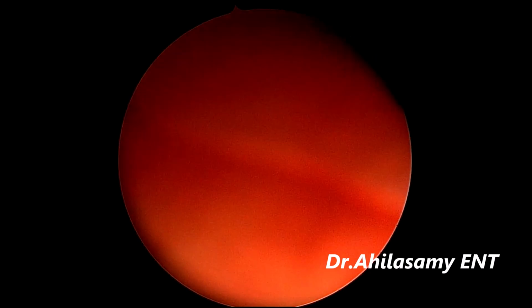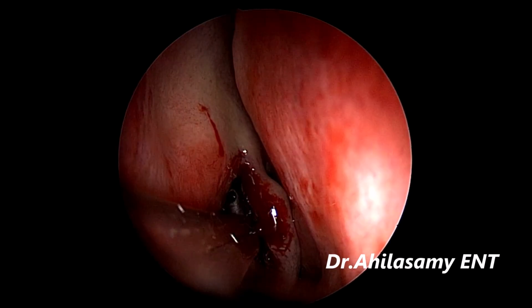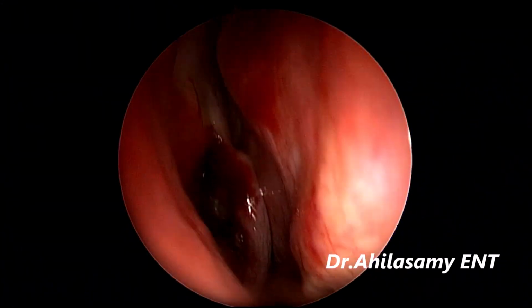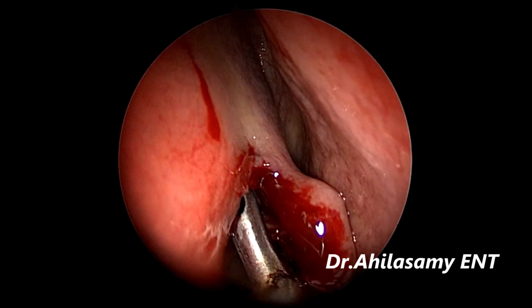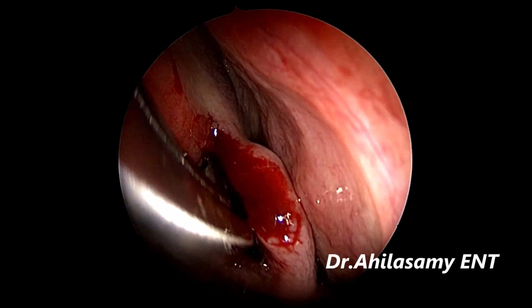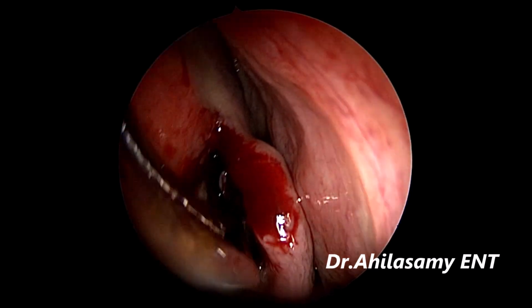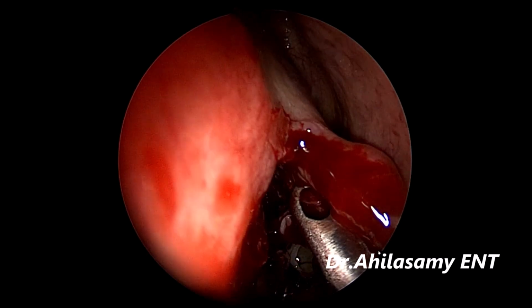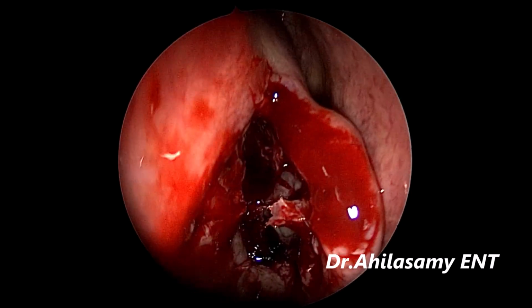That's a frontal recess. So one more frontal cell taken with the Blakesley. That's a frontal sinus coming into view. Now I am operating with a 70-degree telescope. Always use a 70-degree telescope to work for frontal if you are doing the routine frontal surgery.